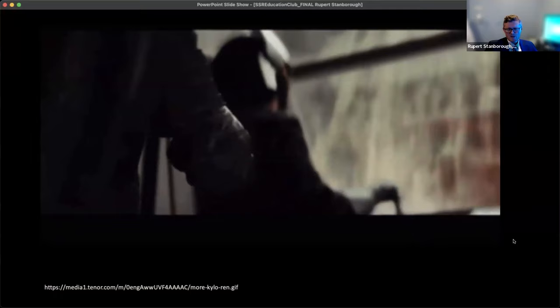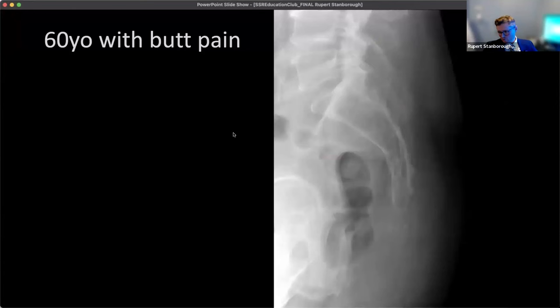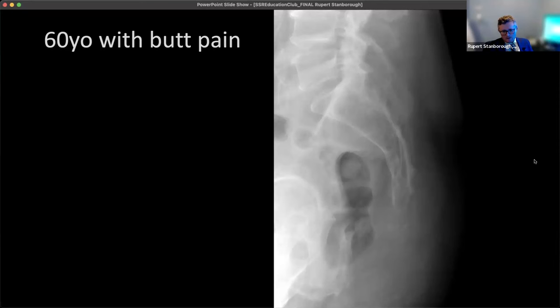One more case. 60-year-old with butt pain. Lateral sacrum radiograph shows a lot of bone missing at the sacrococcygeal junction. We're going to get an MRI. On the sagittal T1 and T2 STIR, we can see the corresponding finding — T2 hyperintense extending outside of bone, corresponding with bone destruction at the lower sacrum and upper coccyx.